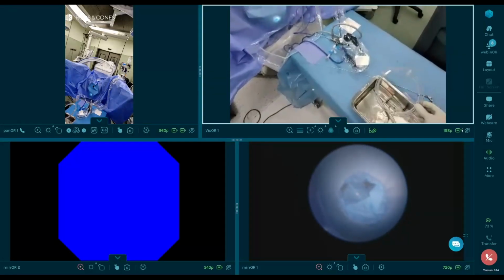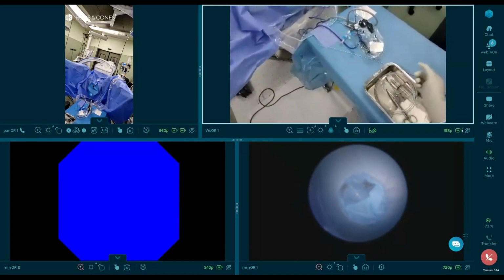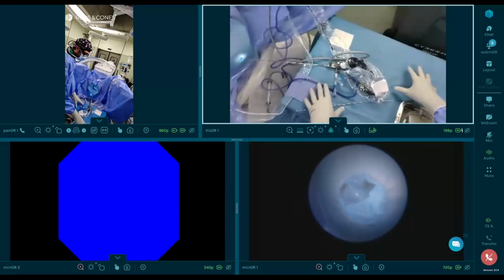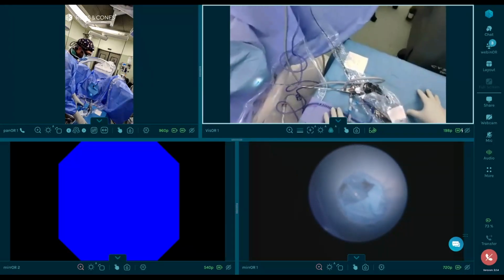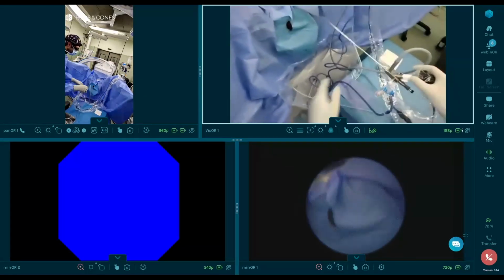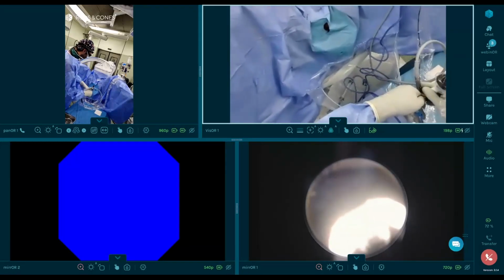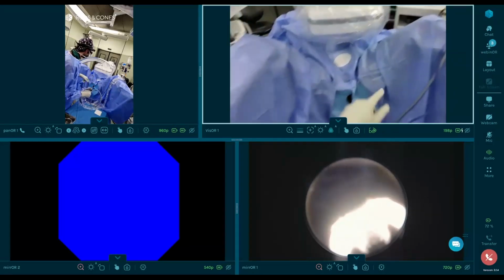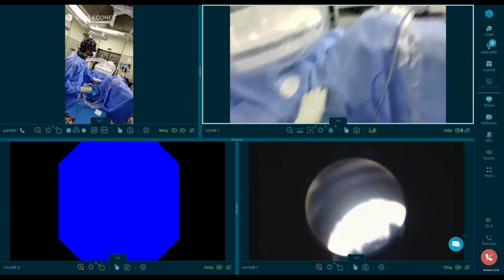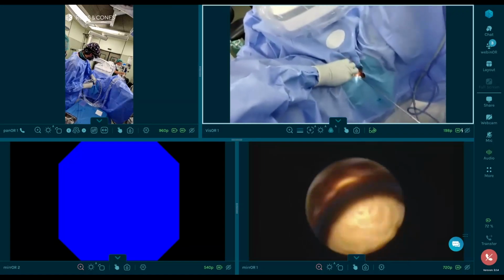So we drape the patient, and I put this table next to me with just a basin with water. I only open one guide wire, my scissors, some wet gauzes, and the syringe, just to have some material. And I very much like this table because I can put my instruments and manipulate myself. So I'm going to start with a semi-rigid ureteroscopy, firstly, to remove the double J. For this, I am using also a manual pump that I always use for my interventions. So let's start here.